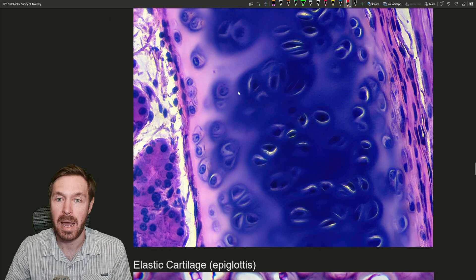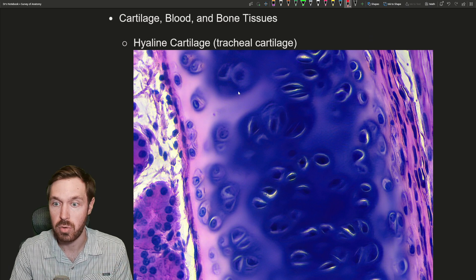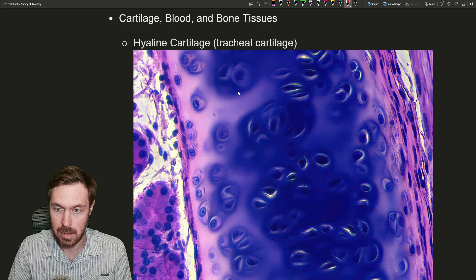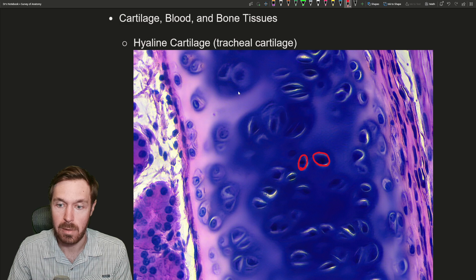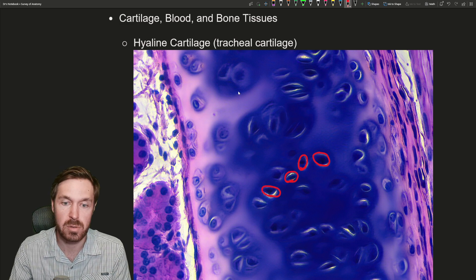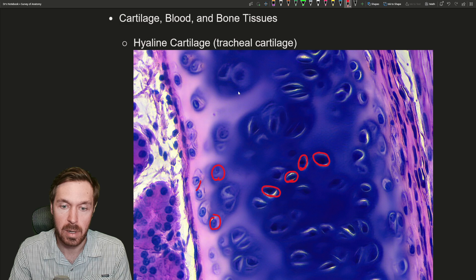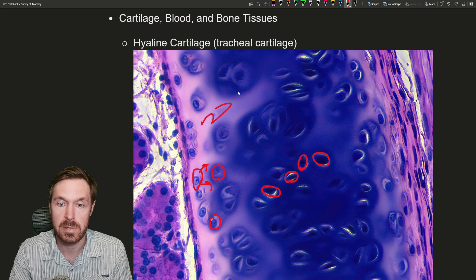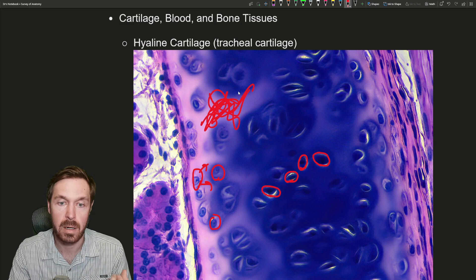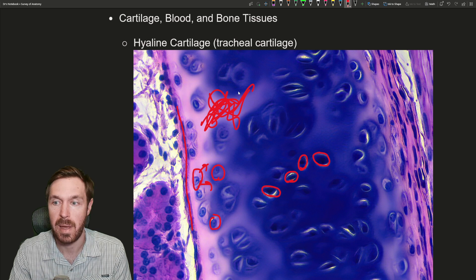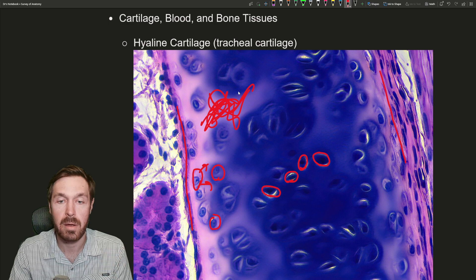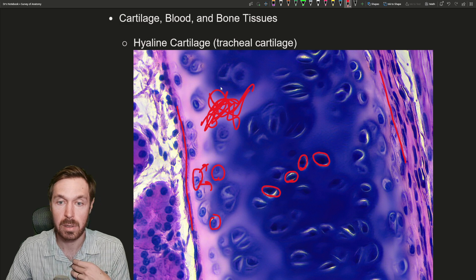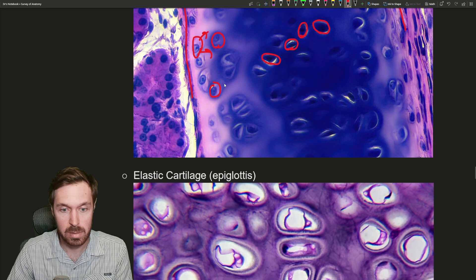Moving on to cartilage — three types. First is hyaline cartilage, and this example is from the trachea — the cartilaginous rings that hold your windpipe open. When looking at cartilage, you're looking for the lacunae: the pockets that hold the chondrocytes. You can see some out here as well. Some of these might be chondroblasts, actively producing ground substance and collagen fibers — irregularly arranged within the cartilage, no vasculature. Out here is the perichondrium, which grows around the cartilage and is where it gets its nutrients. Hyaline is the most abundant cartilage — found in the costal cartilage, trachea, tip of the nose, and ends of long bones.